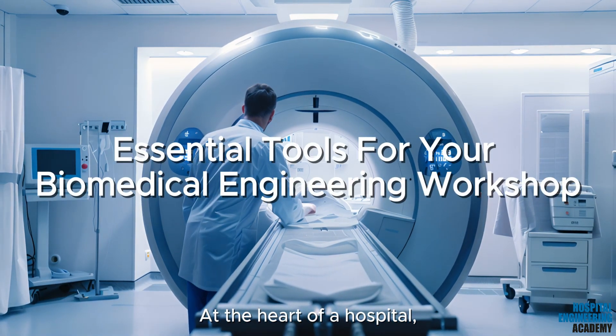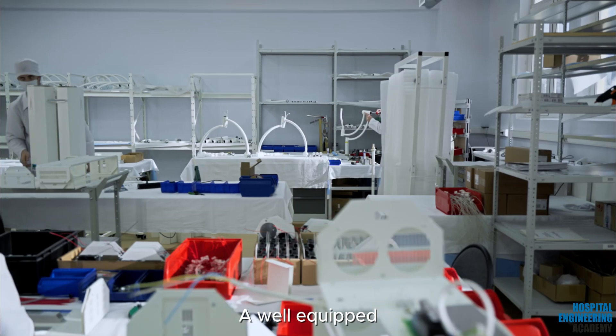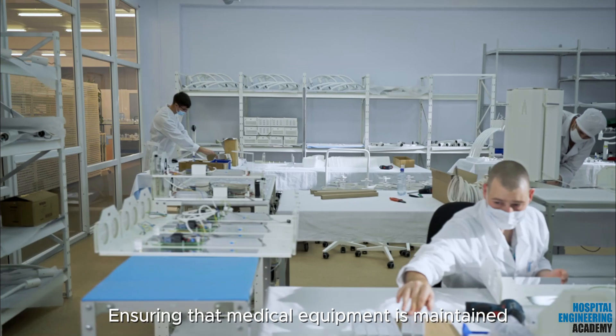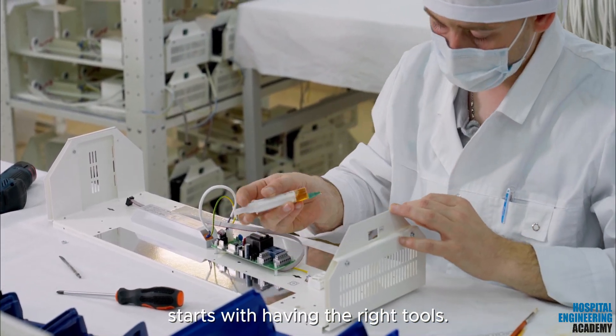At the heart of a hospital, where precision and reliability are paramount, a well-equipped biomedical engineering workshop is essential. Ensuring that medical equipment is maintained, repaired, and calibrated to the highest standards starts with having the right tools.